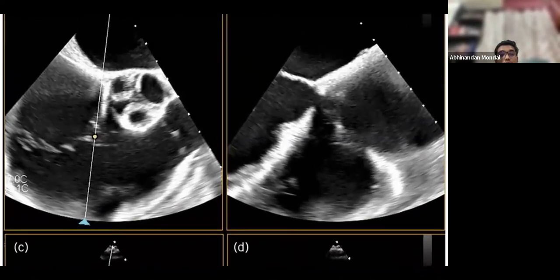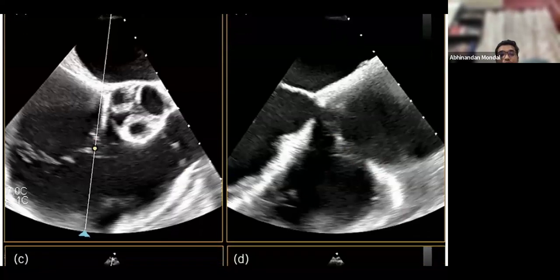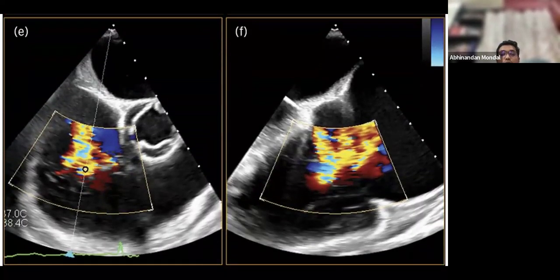In this previous image, you can see it is cutting over your anterior leaflet, and you can see over here, this is septal, this is anterior. Whenever you are going towards your posterior leaflet, it will give you the septal and posterior leaflet. You can also put a color Doppler and put an X-plane through that, and you can examine exactly how big your tricuspid regurgitation jet is.